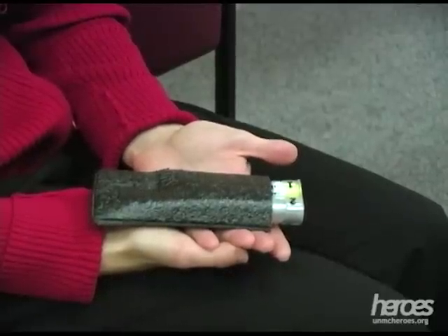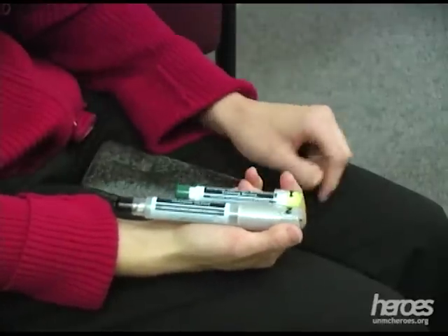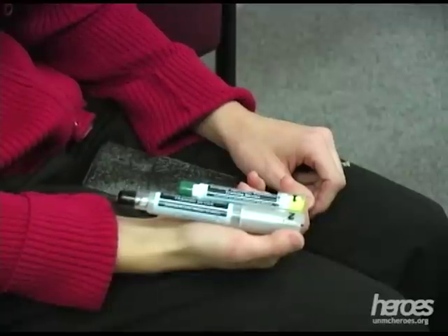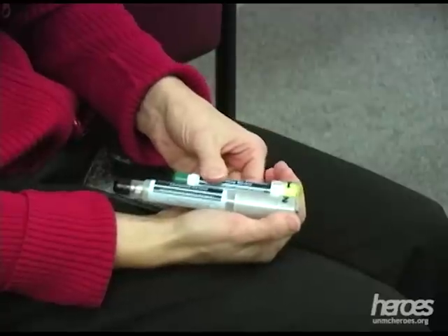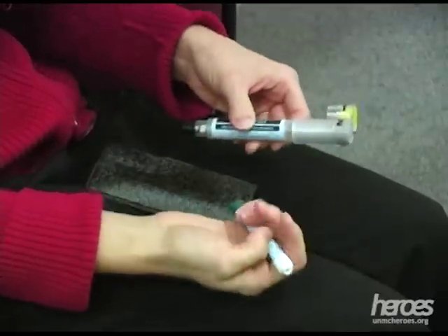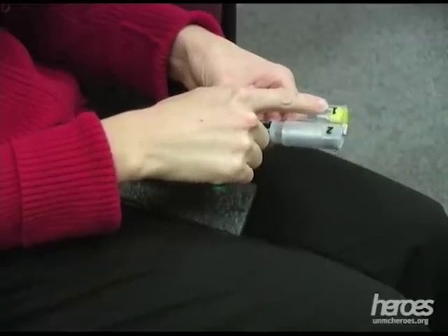First, remove the Mark 1 kit from its sleeve. Take the smaller auto-injector from its holder, which is marked with a number 1, and firmly grasp it in your palm. Make sure that the yellow safety cap is removed.